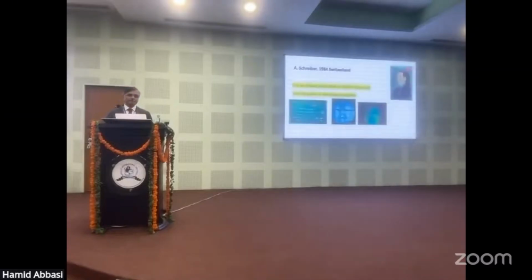Coming from there, a paper in 1984 was the first worldwide publication on lumbar disc endoscopy. And he actually used dual ports, and you know why the dual ports were used. Because there was no working channel endoscope. So they had to put a scope from one side, and from the other side, as a working channel, another scope was put, and then they started doing the dissection. So it was the first dual port arthroscopic nucleotomy, done by Leu from Switzerland.